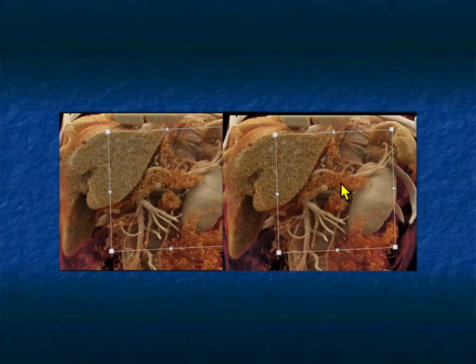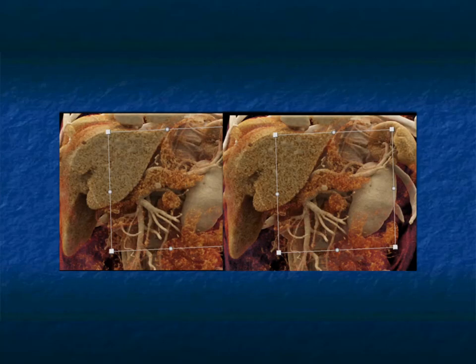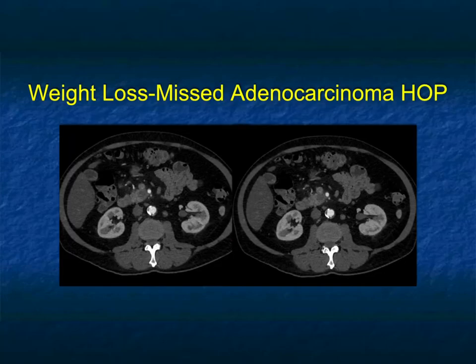And you could see on the cinematic, look how much bigger the lesion looks and how much more obvious the lesion is to see. And as you go to the next set of images, here it is again. So you can see that, yes, I did find the lesion on the regular CT after I knew it was there, perhaps. But look how much more obvious things are on the cinematic rendered image.